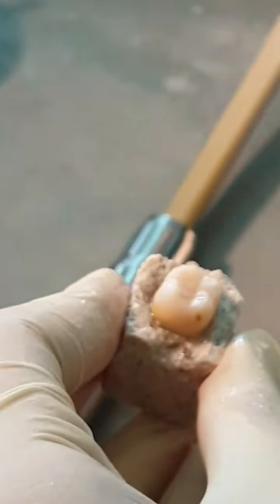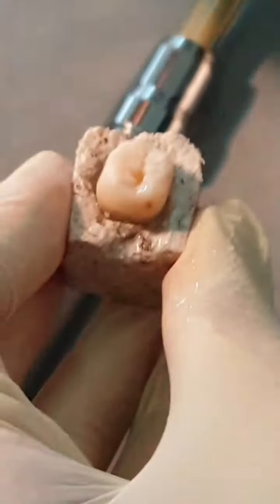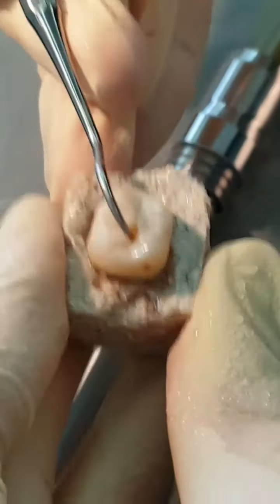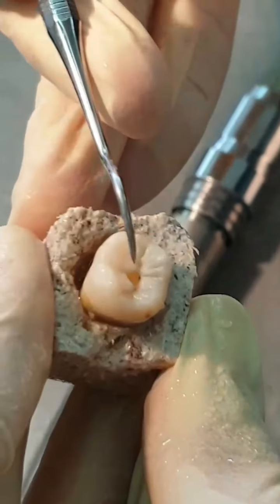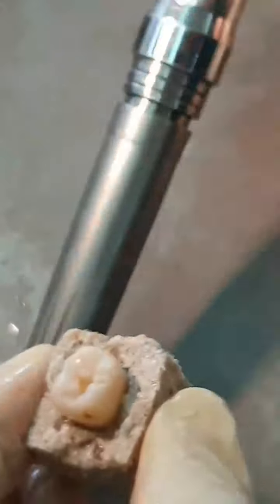Now, we are going to check with the Explorer to see if we are in the pulp chamber area or not. When we check, we can feel a retention just here. So we are in the pulp chamber area. Now, we should complete our access.